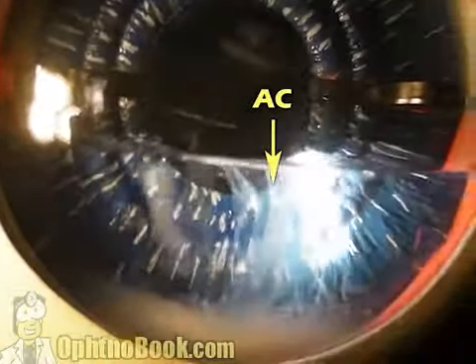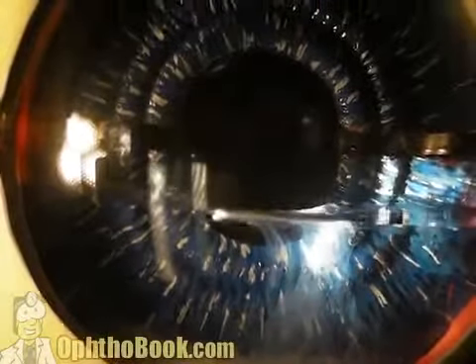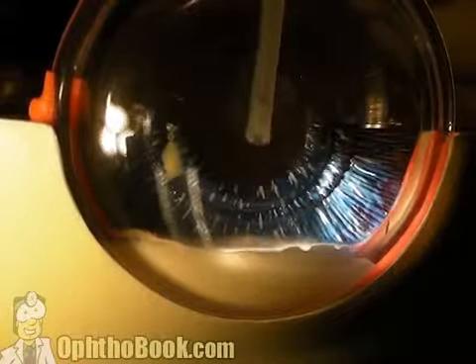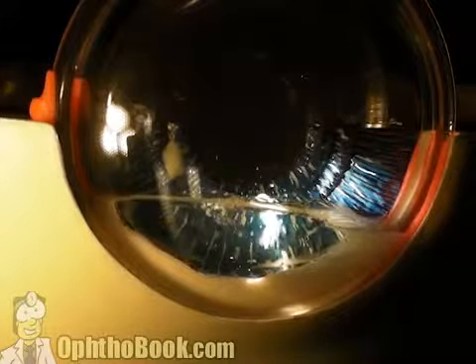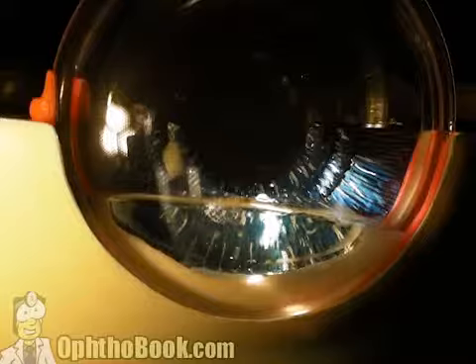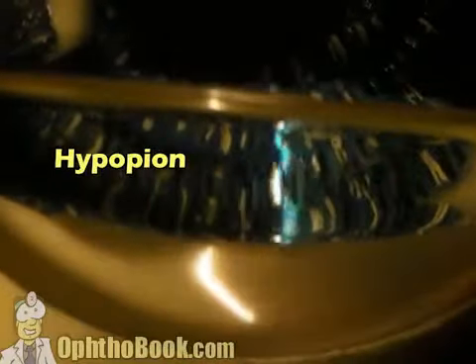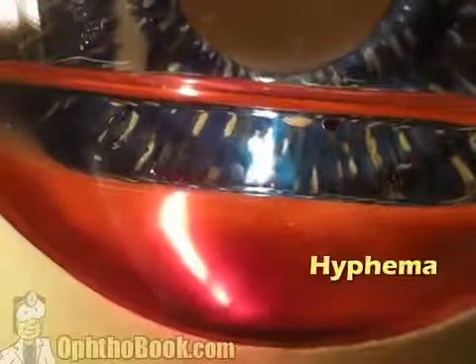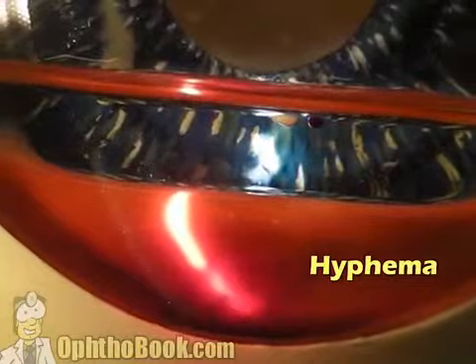And so you can see it a lot easier if you use that black background as opposed to the very illuminated iris. If you have enough inflammation, it's quite easy to see. In fact, if you have enough inflammatory cells, they sink and they'll form a layer of pus in the bottom of the anterior chamber. This is, of course, what we call a hypopyon. Change that to red blood cells, and this is what we call a hyphema, or bleeding in the bottom part of the eye. Okay.